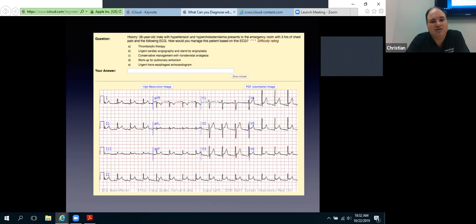Just go 1, 2, 3, 4, 5, 6, 7, 8, 9, 10, 11, 12, 13, 14. Multiply that by 6, right? So that's 60 plus 24 is 84. So that's a rate of about 84. You'll see that here again: if you find one that's on a line, 300, 150, 100, it's between 100 and 75. So 84 makes sense.